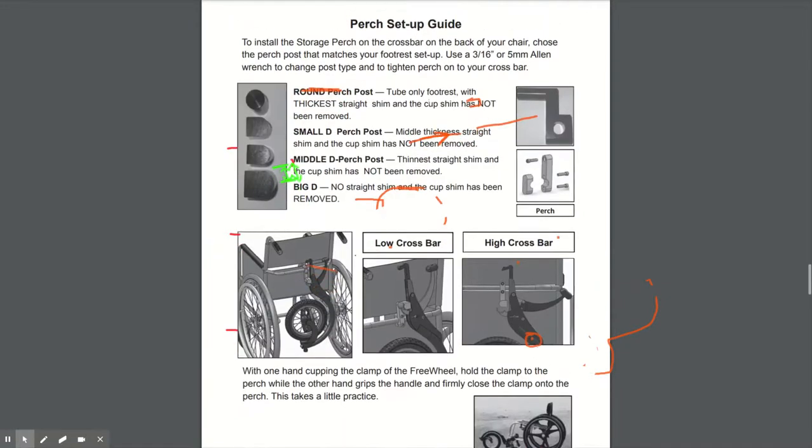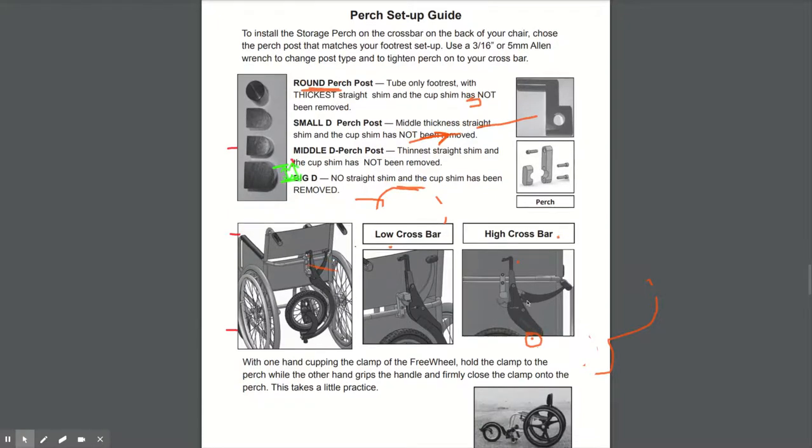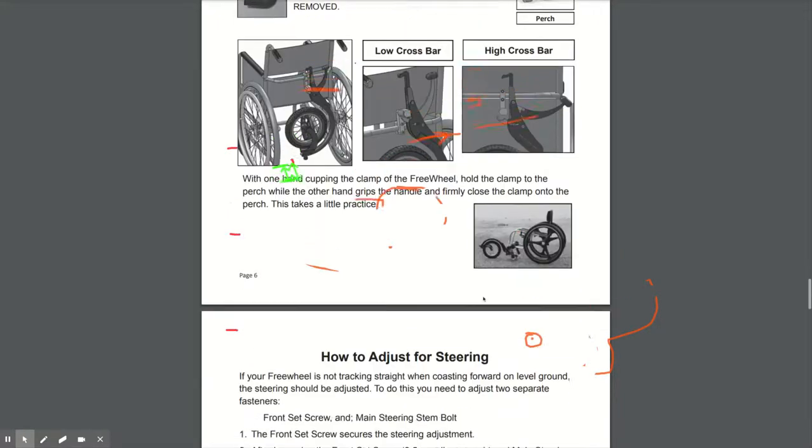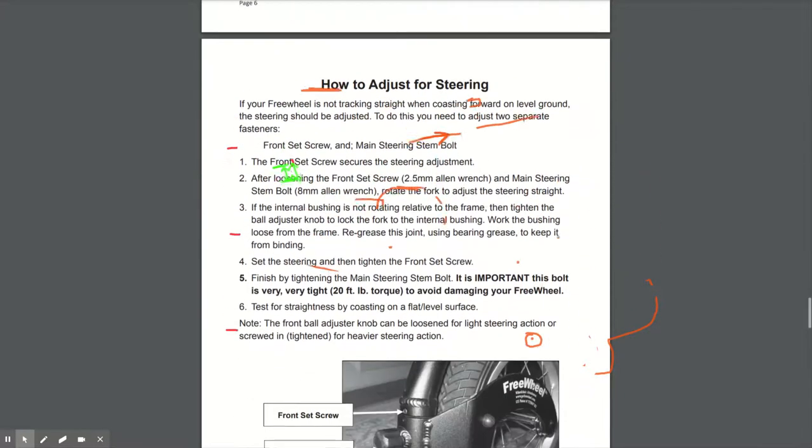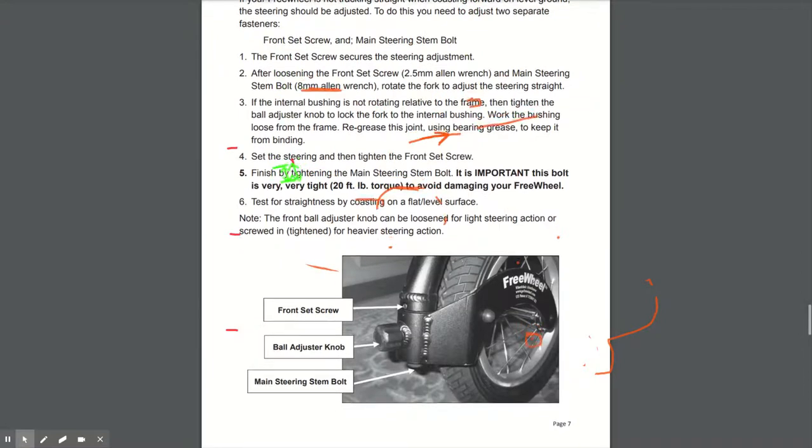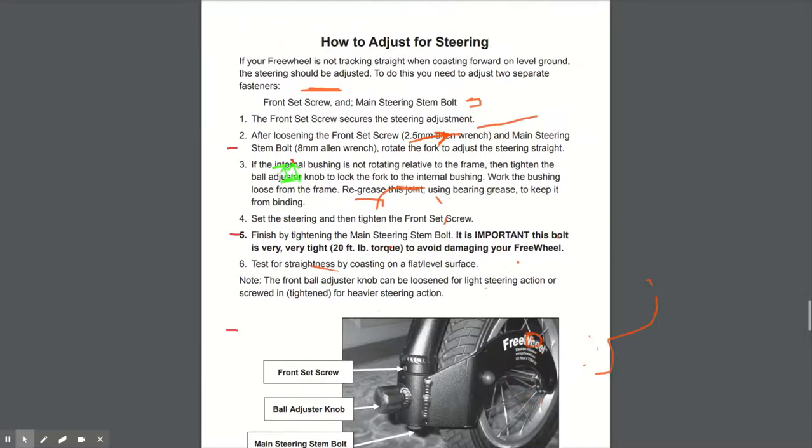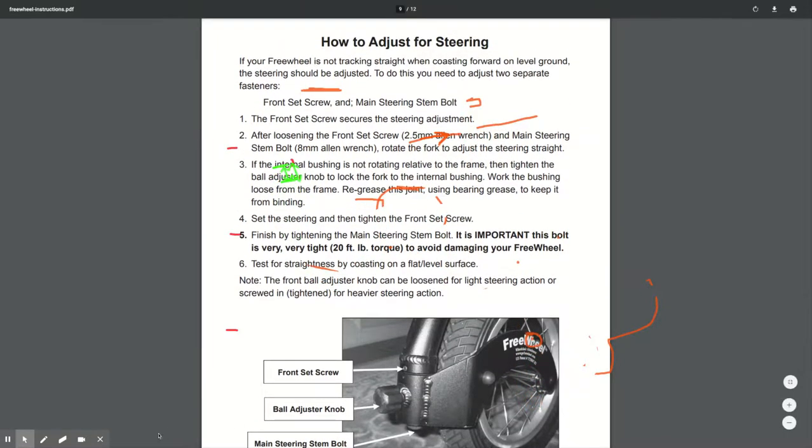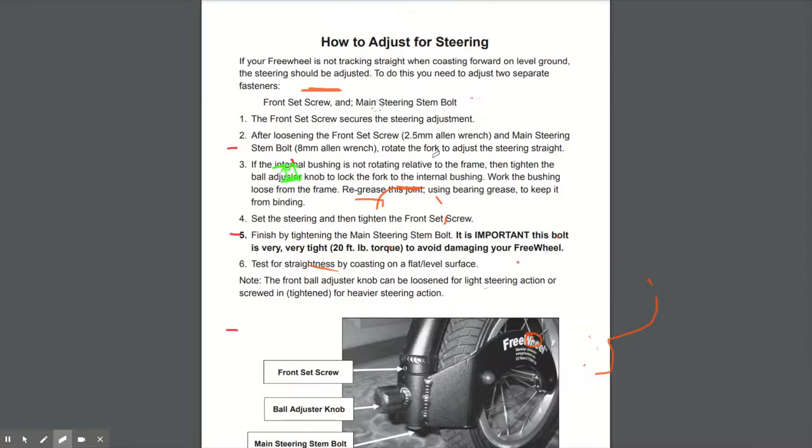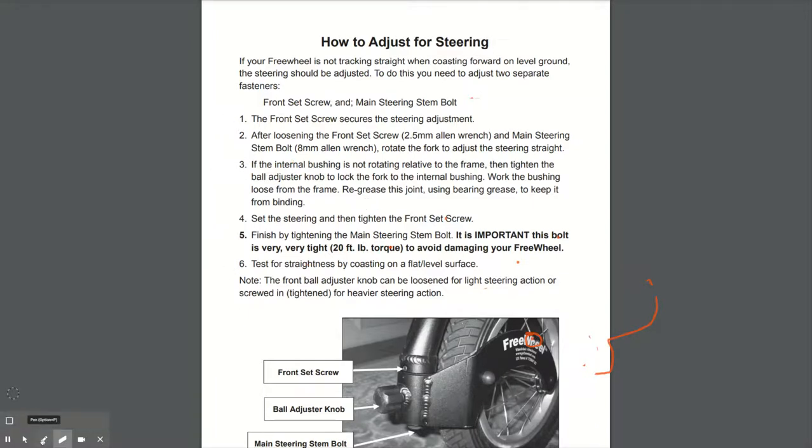You've then got the perch set up, which goes on the rear of your backrest in order to fit the freewheel to when you haven't got it on the front. And then you can adjust the steering in terms of how stiff or easy it is to turn. But those are the essential steps in order to get it set up correctly.